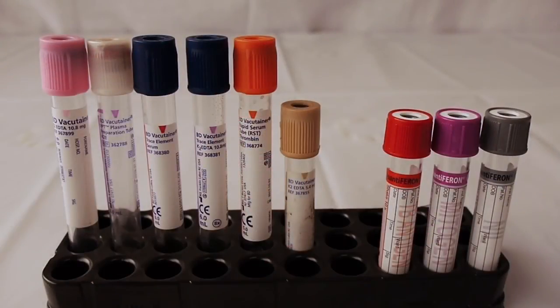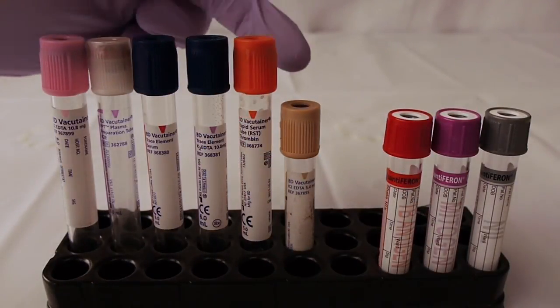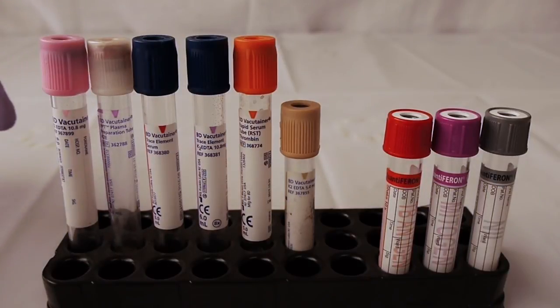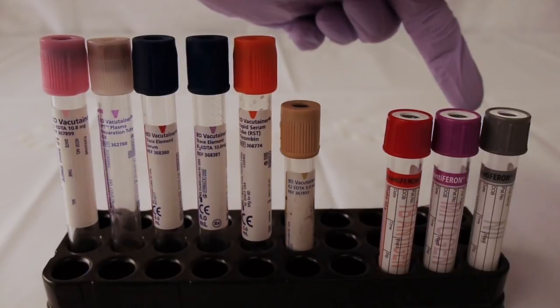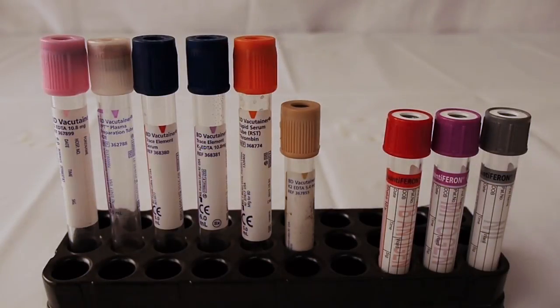Now, the tubes on the left are all eight inversions. The quantiferon tubes are to be shaken at least 10 times.